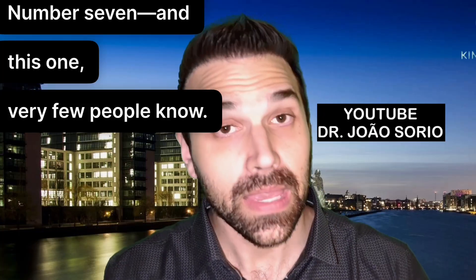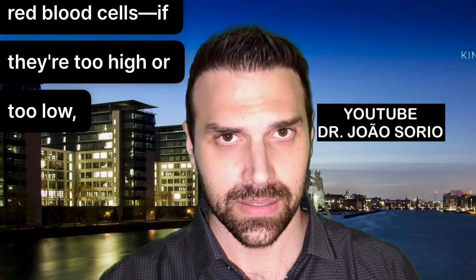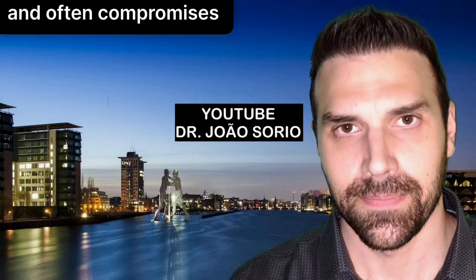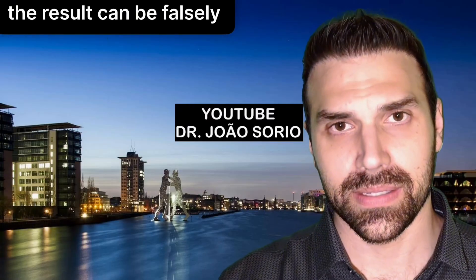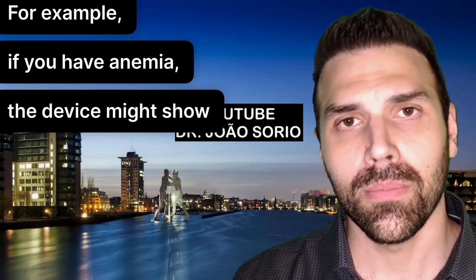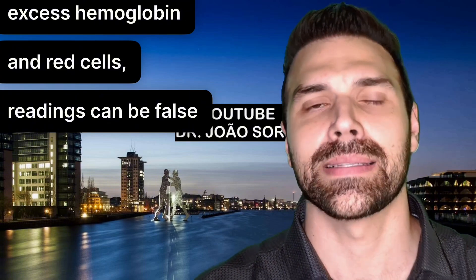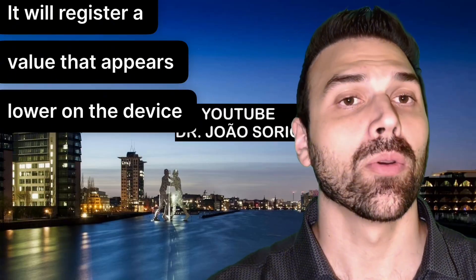Number seven, and very few people know this: hemoglobin levels and hematocrit — red blood cells — if they're too high or too low, like in anemia or thick blood called polycythemia, can alter the result. The proportion of red cells changes and often compromises the reading. In cases of anemia with fewer red blood cells, the result can be falsely elevated — the device might show a higher value than actual.